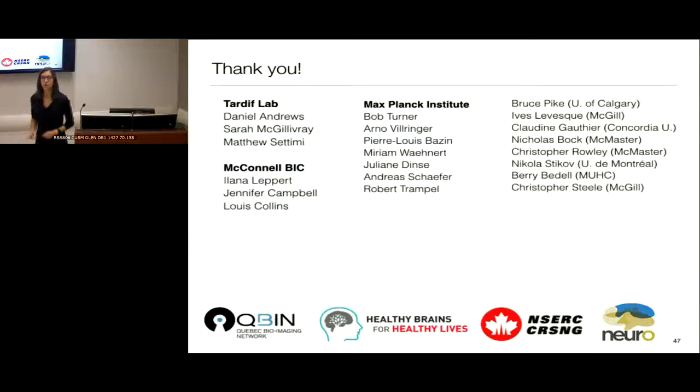There's been really great work done in Boston, by Tisdale, I forget who the senior author is on it, where they do prospective motion correction using navigators. These are the really low resolution images that are acquired throughout your scan to update the field of view.